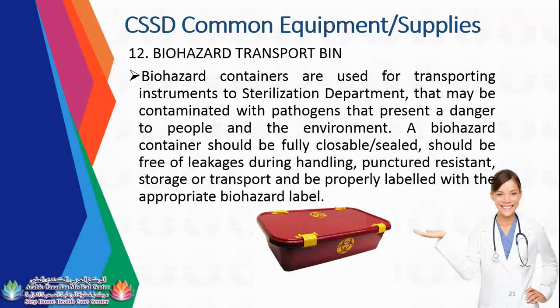This is your biohazard transport bin. Once you get a soiled instrument, it should be placed in a biohazard transport bin. Your biohazard transport bin has a lock with biohazard logo. So biohazard containers are used for transporting instruments to the sterilization department that may be contaminated with pathogens that present a danger to people and the environment. A biohazard container should be fully closable, sealed, free of leakage during handling, puncture resistant during storage or transport, and be properly labeled with the appropriate biohazard label.